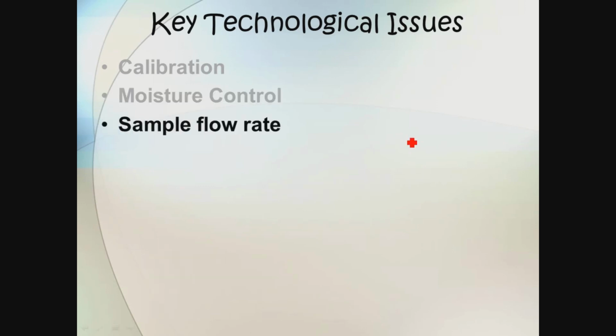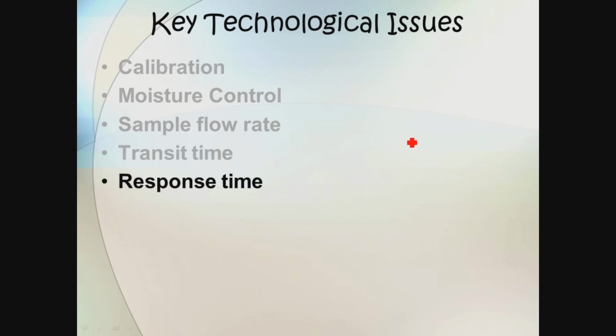Depends upon how fast the sample flow rate. It's one of the beauties of the microstream is that although it's a side stream analyzer, its sampling rate is almost as good as a mainstream. So you don't have any lag that is there. How long the sampling time is, the transit time, what the response time is. These are all technical problems that can be involved here.